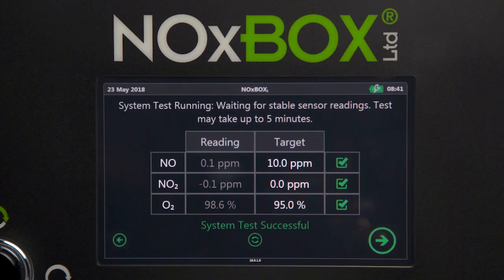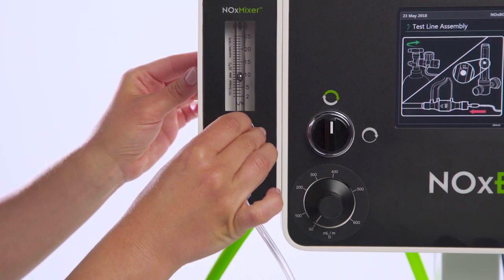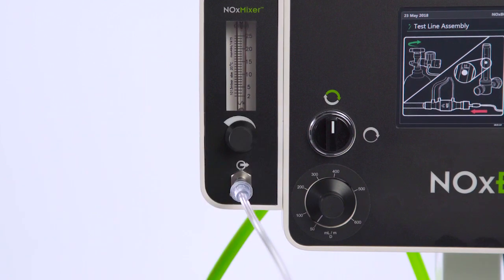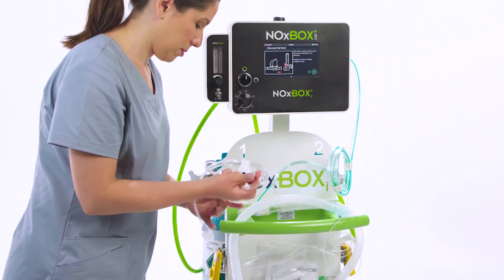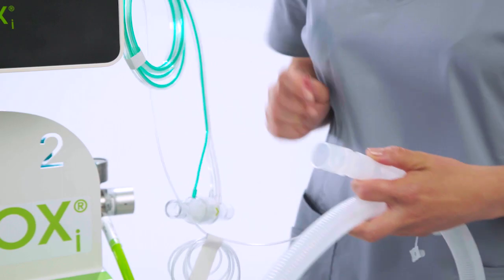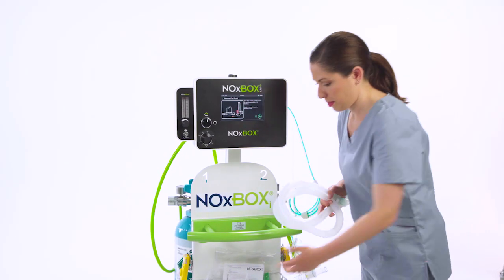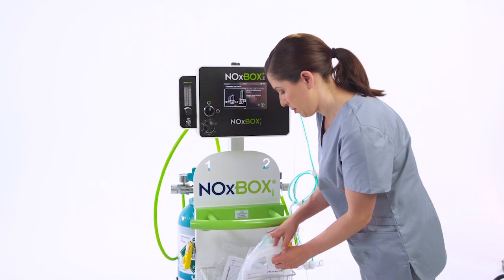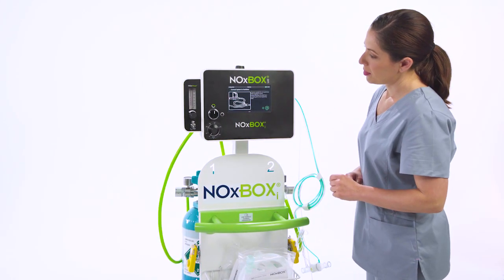Once all tests have been successfully completed, you can disconnect the test circuit and complete the setup. Rotate the NOx mixer oxygen flow control clockwise to turn off the oxygen flow. Disconnect the oxygen tubing from the NOx mixer outlet and NOx flow and place back in the test kit packaging for safekeeping. The corrugated tubing supplied with the system test kit is no longer needed and should also be disconnected from the NOx flow and sample line and placed back in the test kit for safekeeping. Now you are ready to start therapy and set the dose or place the NOxBOXi system in standby mode.